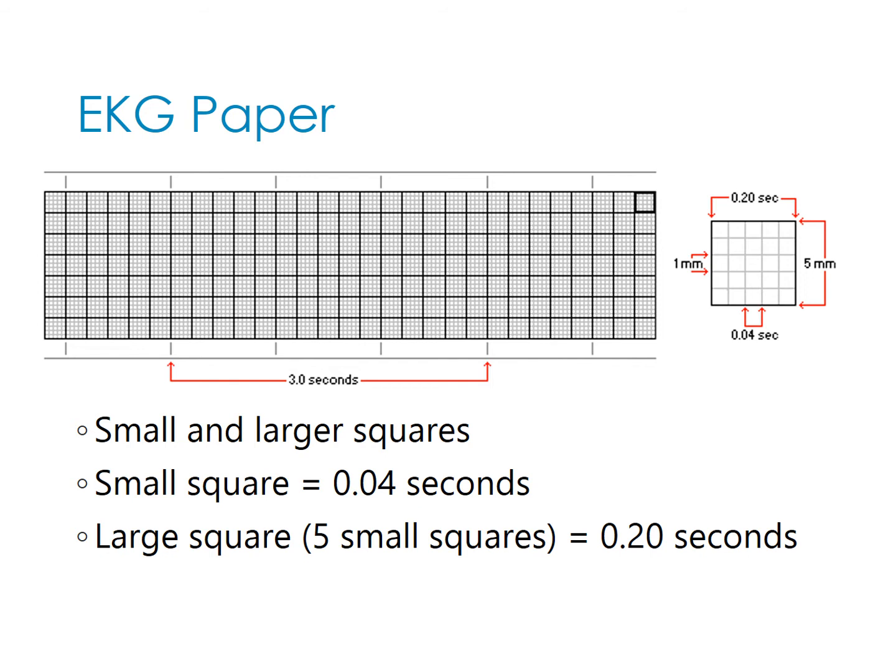Okay, so this is also called the rule of 10, which is the quickest way to measure rate, but it's really considered the most inaccurate. For all intents and purposes, it gives us a decent understanding of how fast the heart is beating. For beginning interpretation, this is fine. I believe Yvette will teach you the counting method, which is a little bit more complex, but your heads are going to be kind of full with all of this stuff right now, so I just want to give you the easiest way to go at this point.